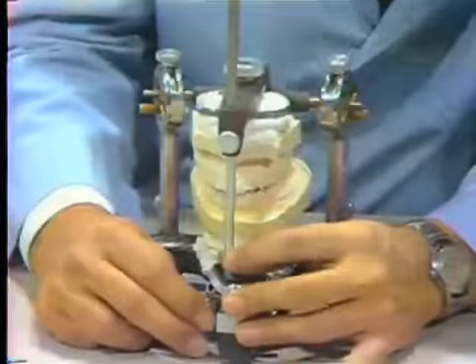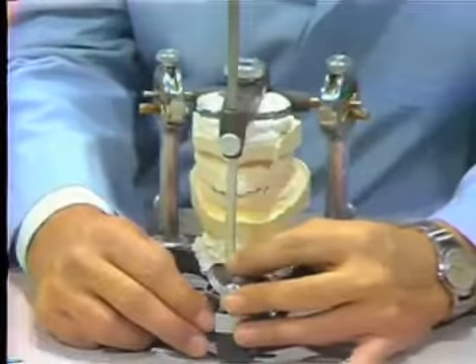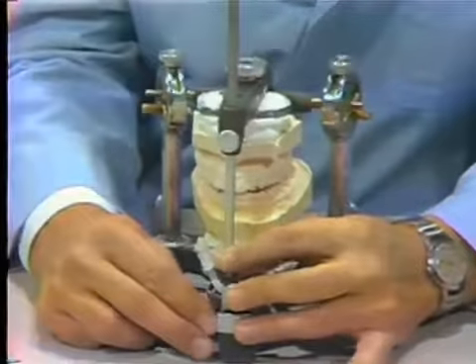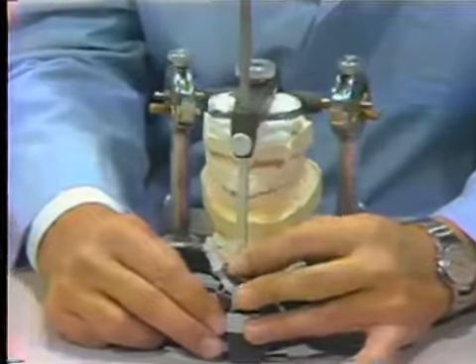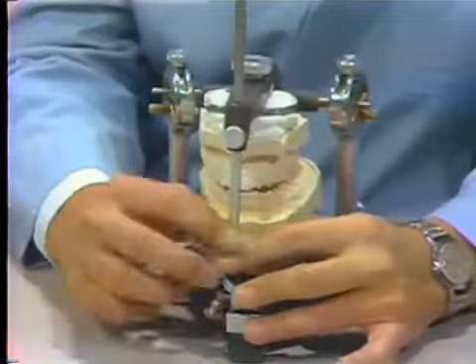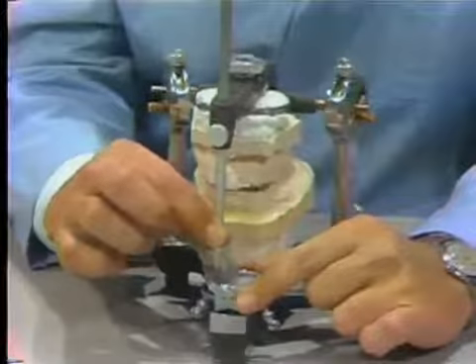And thus make the articulator accept this lateral guidance. Just a little bit short yet. I raise it just a little more, and I can move the articulator so that the stone casts are not abrading and the pin is taking the brunt, or is producing the guidance.